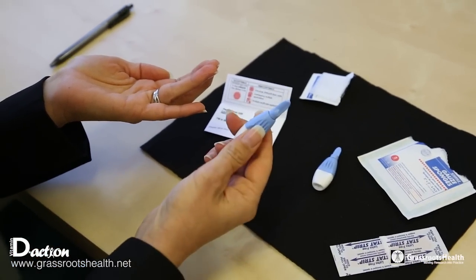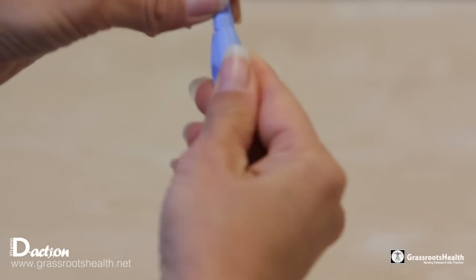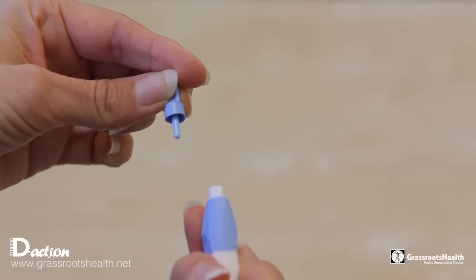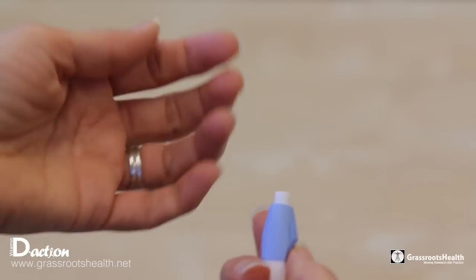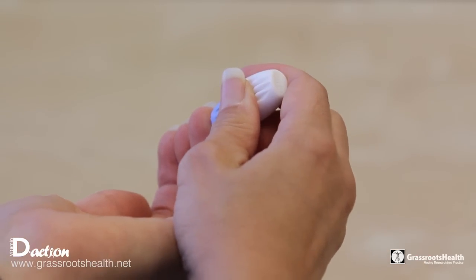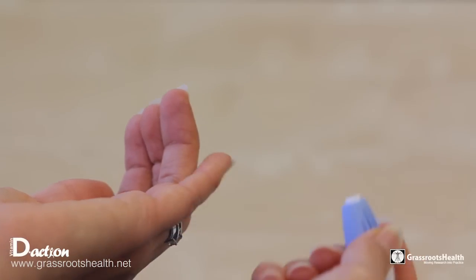Take a look and see how the lancet is opened. Generally you will only need one — there is an extra one in there. You just take off the top of it, press it up against the side of the finger, and press, and it gently clicks.